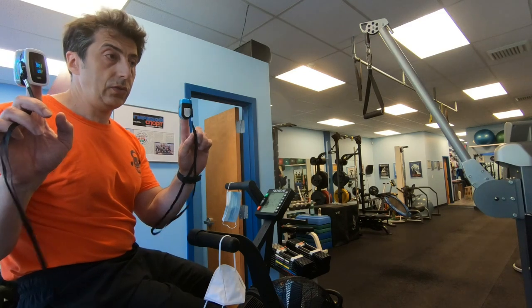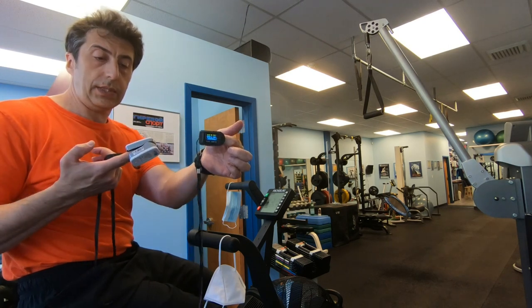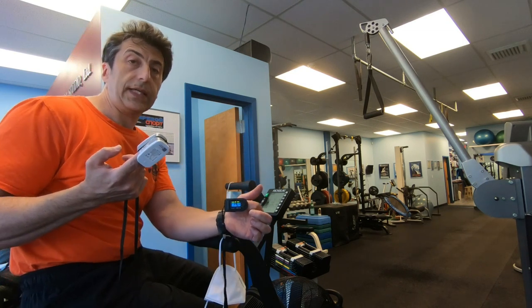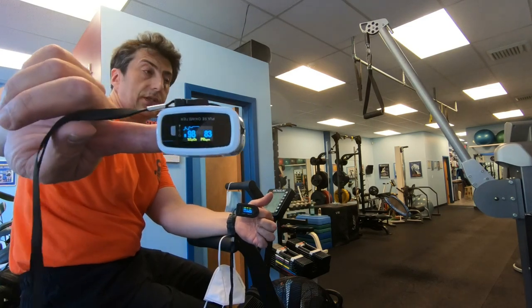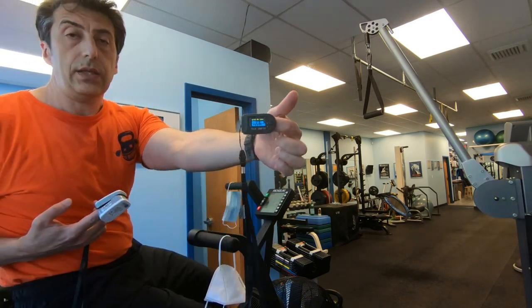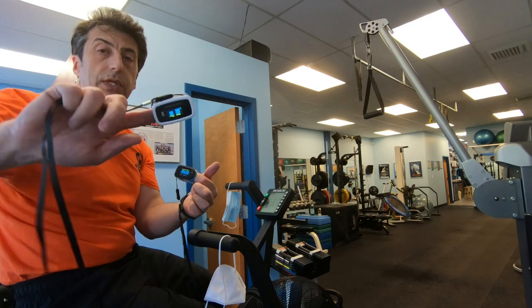So I'm wearing two blood oximeters. They're from two different companies, but both are used in medical clinics to measure blood oxygen saturation. Everything above 95 is considered a good oxygen saturation. So this one shows 98, this one shows 99. They both have about a 2% margin of error, but it's both good. Well, this one shows 99 now too.